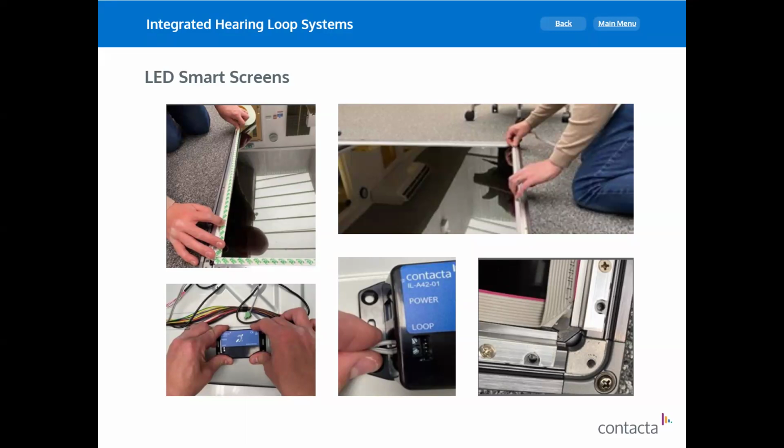They have smart screens, so that the kid will stand in front of the screen and do presentations and touch the screen and draw things, write things, and the teacher, of course, would as well. So those are interactive smart screens. And obviously there's sound coming out of them, and the law in different countries requires that this is accessible for children and teachers with hearing loss.